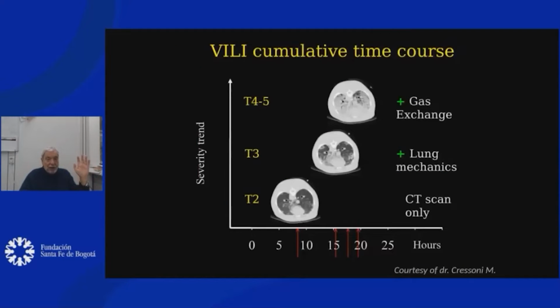So tidal volume, no doubt. And it is important also to consider the time. These are the evolution, these are hours, and look at the CT scan.